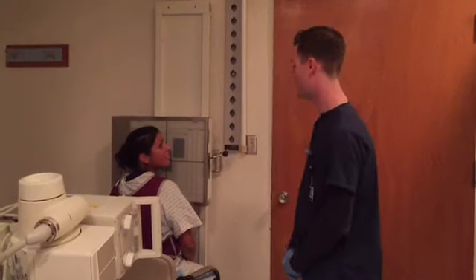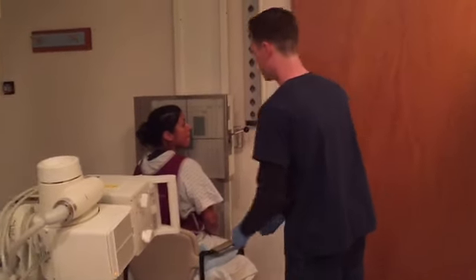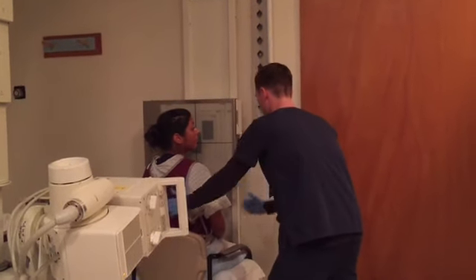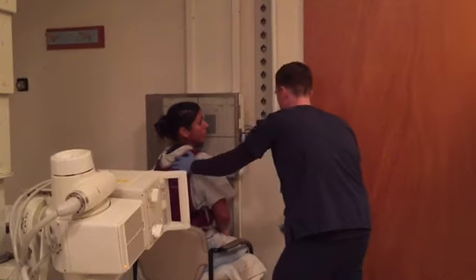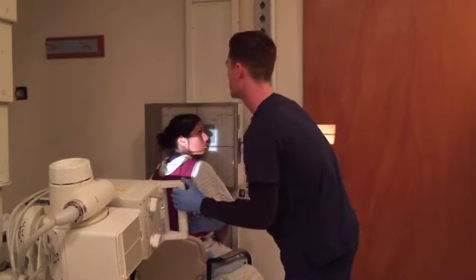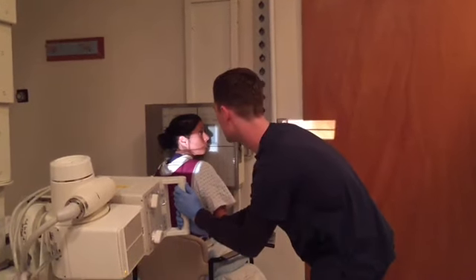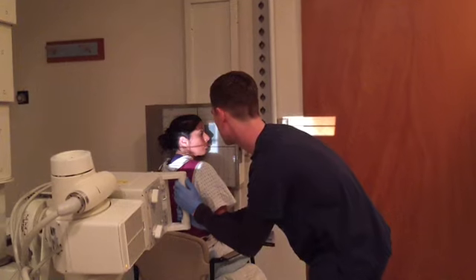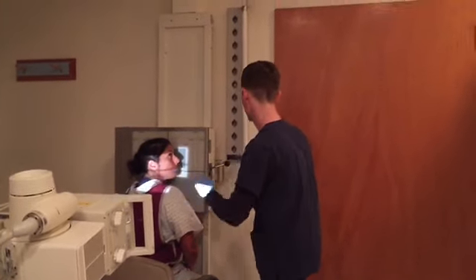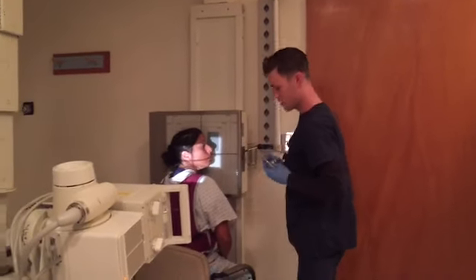Alright, now to continue the mandible series, we're going to do 3 oblique images. We're going to have the patient turn into an LAO position so that the head is in a true lateral again. So scoot a little bit closer to the bucky for me. Place the left side of your face up against the IR. Here we're going to have the central ray entering the mandibular region right about at the gonions. I'm going to tube up. We're going to have a 25-degree cephalic angle for all three of these. I'm going to adjust the bucky. Use my left marker.